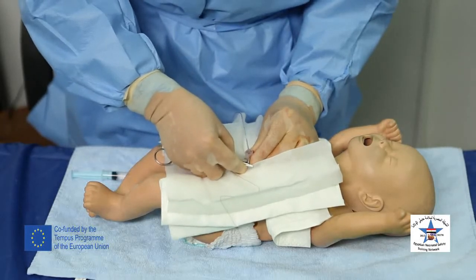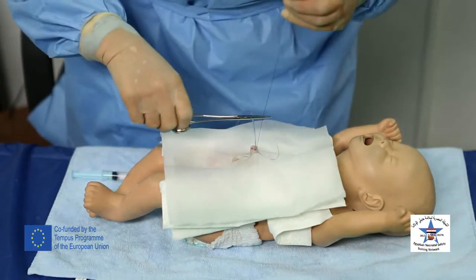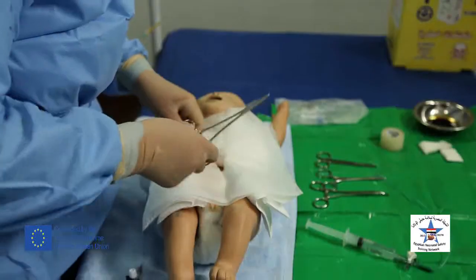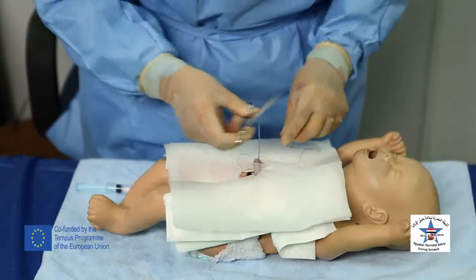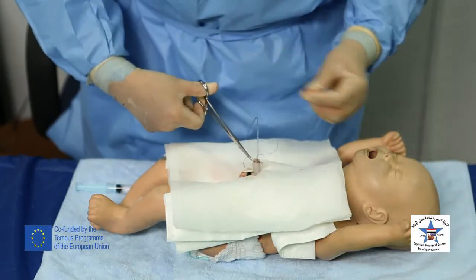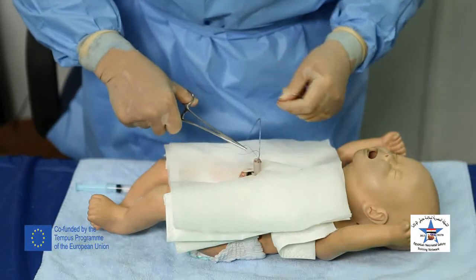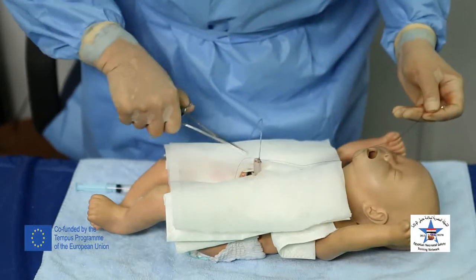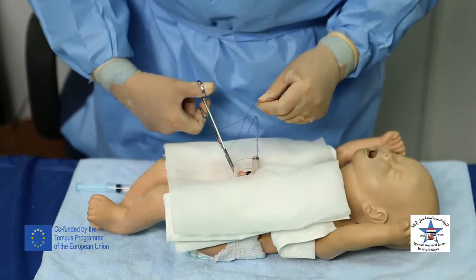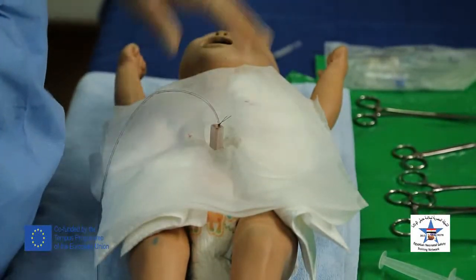Take a purse string suture and roll the thread around the umbilical venous catheter. Make sure to dispose any sharp objects in the safety box.